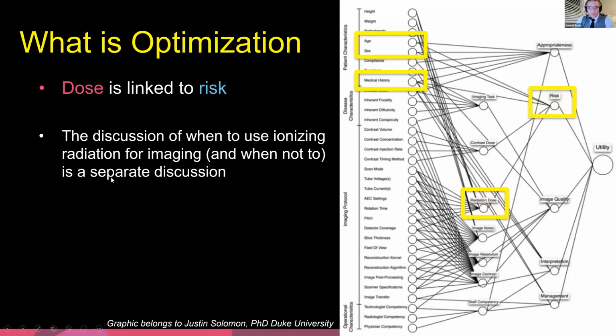it's not really appropriate for this talk, but this idea of appropriateness, I think, is probably one of the best ways to reduce patient radiation risk. Is the imaging appropriate? Is the task necessary? And if it is, then obviously the next step is to make sure we got the right image quality and the right dose. But if it's not appropriate, then removing the need to make those images or to scan those patients really reduces the amount of radiation dose we give to our patients, because we're taking that away, and it obviously completely reduces the risk to that patient.